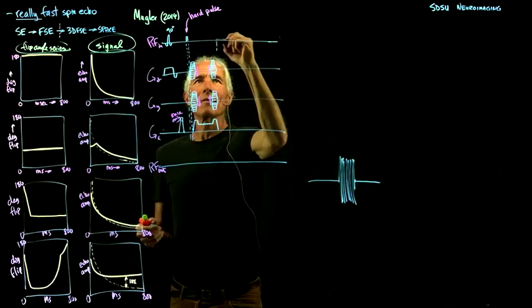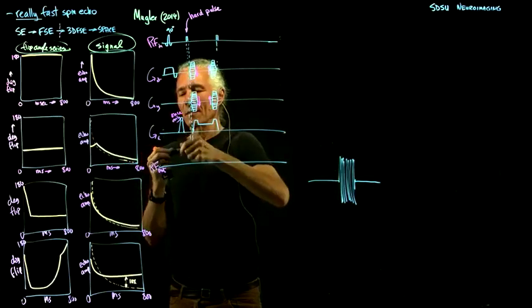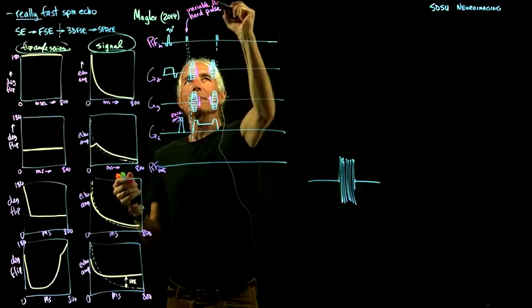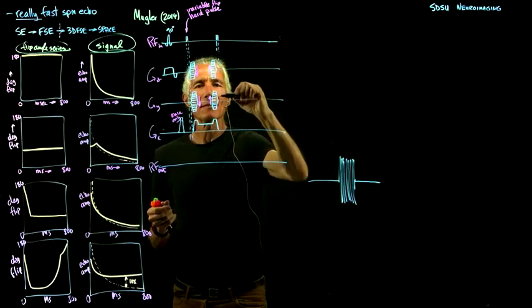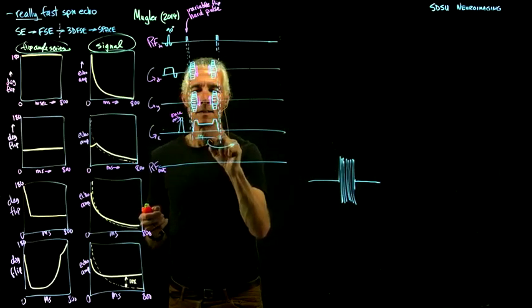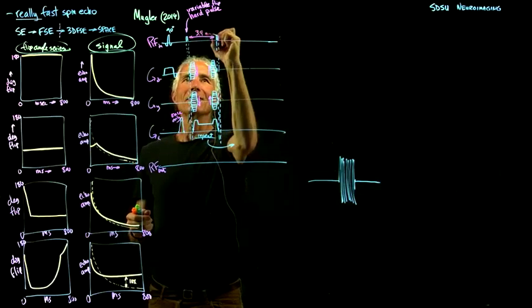And so now we just do another RF pulse. Now the amplitude of those pulses are changing because you're doing this to them. So these are variable flip, because we're doing this strange thing to them. But now they managed to jam everything down, so now we're repeating. So here's the repeat. They managed to jam everything down to 3.9 milliseconds. So that is really short.